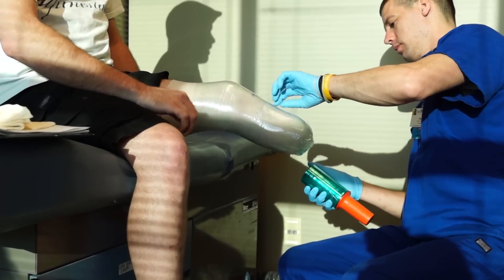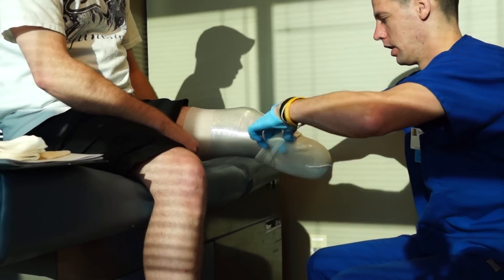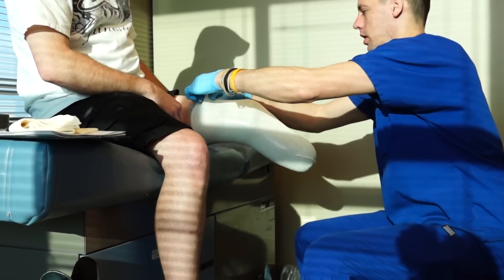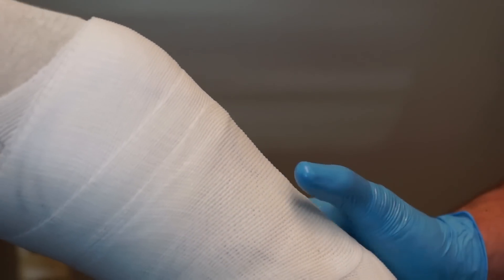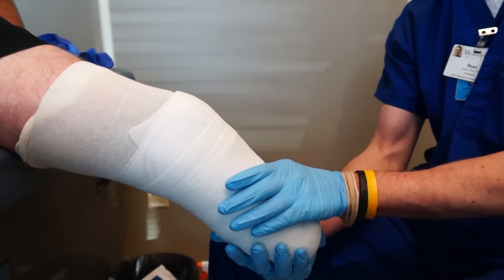The process of making a running leg starts with taking a cast of your residual limb so that a prosthetist can create a socket to be used with your running blade. The reason prosthetists don't simply duplicate your current socket is because running legs frequently use a different suspension system than your current socket, and they want to ensure the best fit.